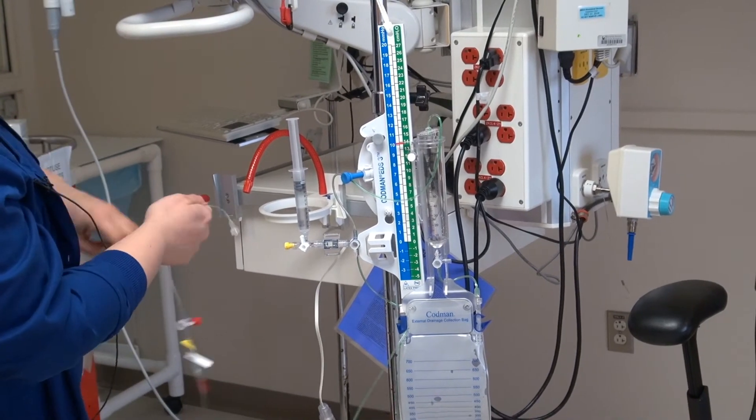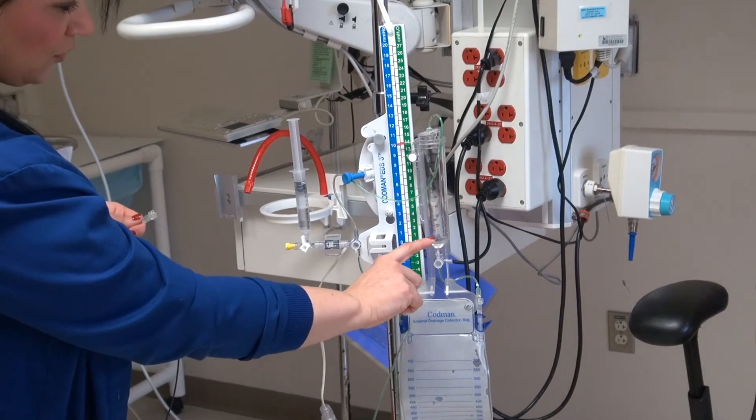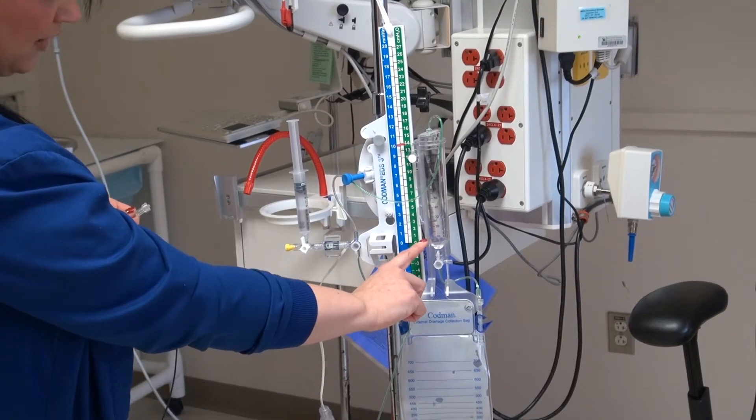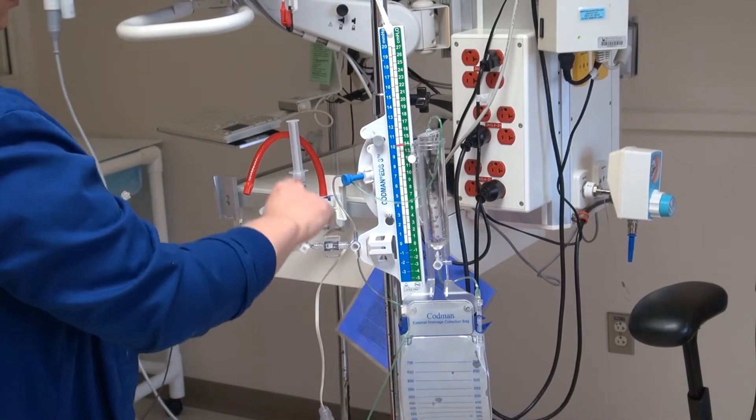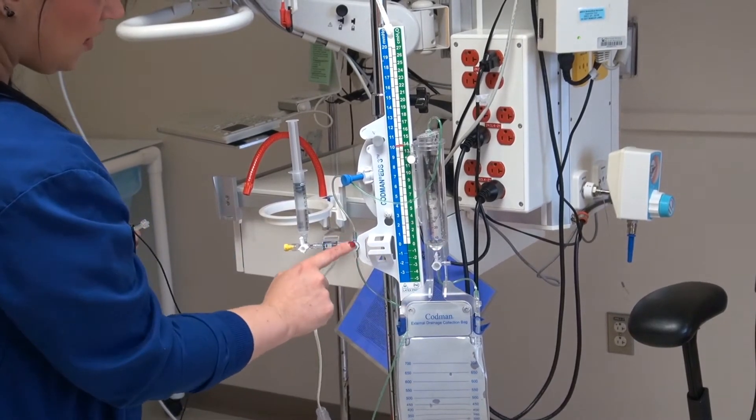Once the neurosurgeon is ready, we are going to hook these up, but you also want to make sure there's no saline in this chamber because this is where our cerebrospinal fluid is going to be drained through. So we'll make sure it's off, which it is.